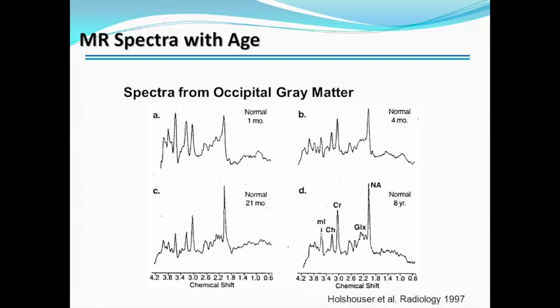But we have a version. So anyway, it's basically the area under the curve that you want, right? You can do it in MATLAB too. It's just, yeah.